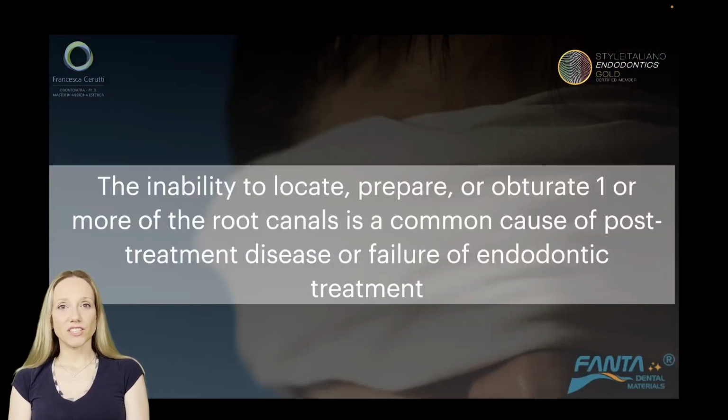But sometimes it's not so easy to do, because if we are not able to locate or to treat part of the anatomy of the tooth, our patient could develop a post-treatment disease and our therapy could evolve into a failure instead of becoming a success.